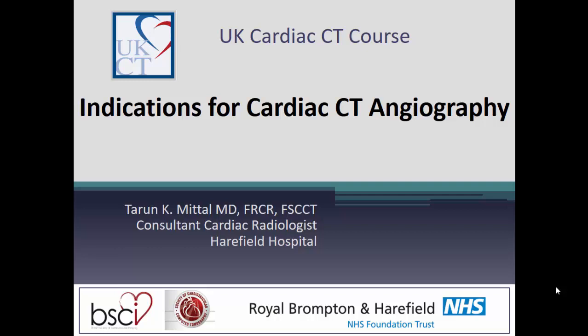Okay, so we'll start with the indications for cardiac CT angiography. Now, Andrew has already covered a lot of what I'm going to say, so I'm going to run fast through those topics that Andrew has covered and just focus on some salient points about them perhaps, and then look at some of the indications that he might not have included in his talk.